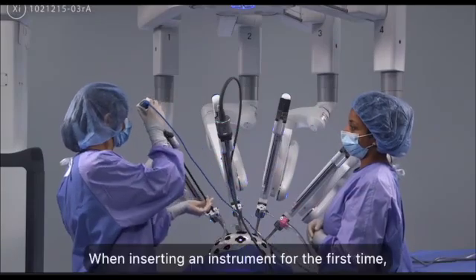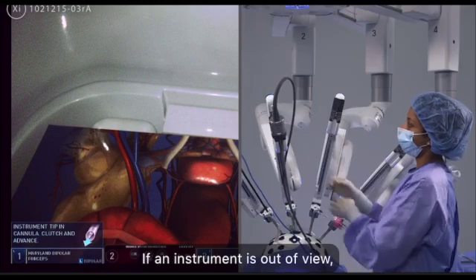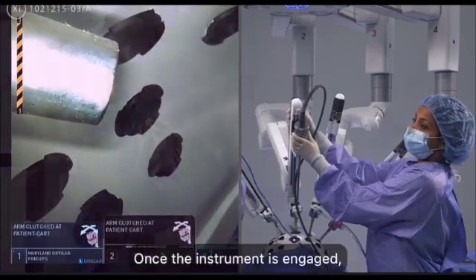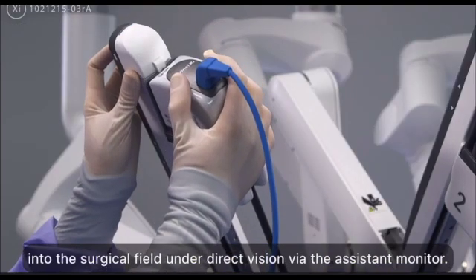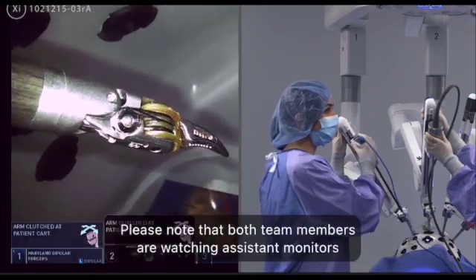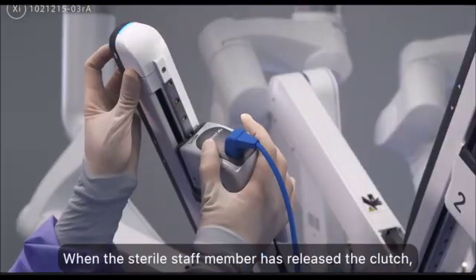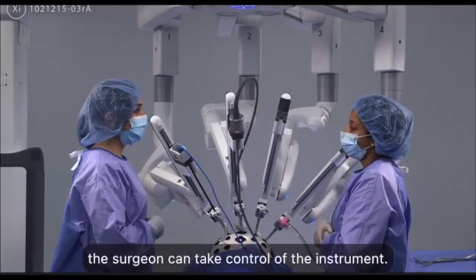When inserting an instrument for the first time, always insert under direct vision. If an instrument is out of view, you will see an off-screen tool indicator on the vision cart monitor. Once the instrument is engaged, a sterile staff member will guide the instrument into the surgical field under direct vision via the assistant monitor. Please note that both team members are watching assistant monitors while inserting instruments and controlling the endoscope. When the sterile staff member has released the clutch, the surgeon can take control of the instrument.